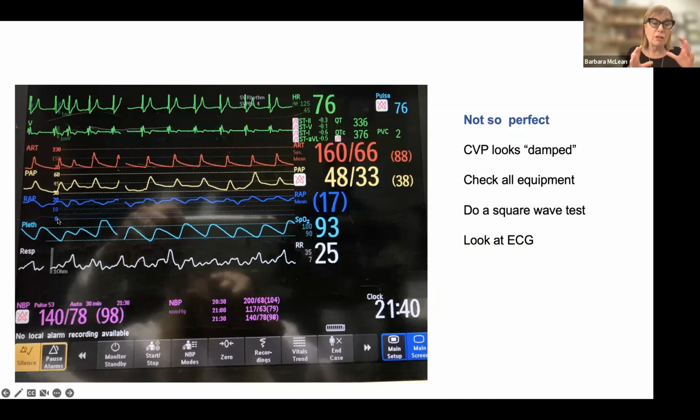But before I make any decision, I'm always going to go over here and say, is this the right scale? The scale is the window at which I'll look at the pressure, and the pressure is 17, so the scale is 0 to 20. That's perfect. This is an optimized scale. It's the right scale for the waveform. The other thing I'm going to do is make sure that there's no air bubbles in my system, that I'm level, and that my pressure bag is at 300 millimeters of mercury.